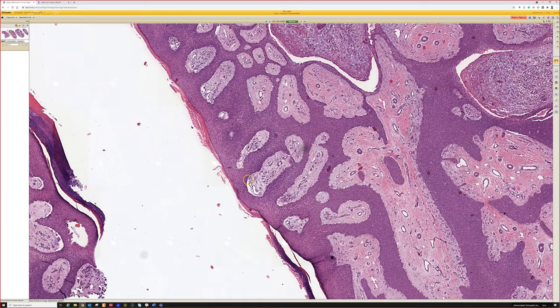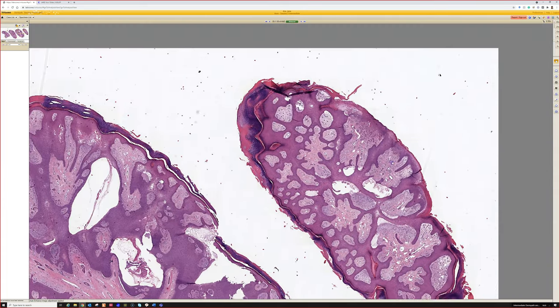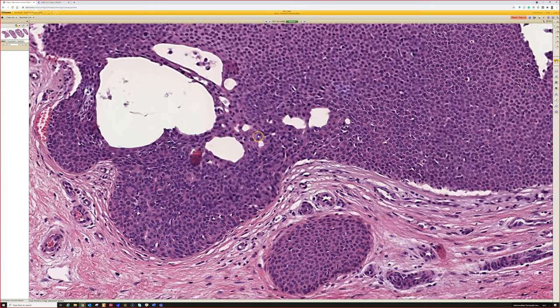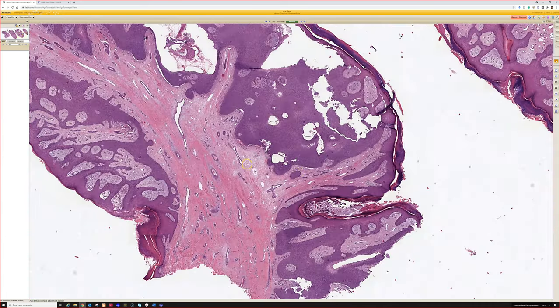situ. All right, well, I don't remember where the little tiny ducts were, and I guess it's not that important because all the other features here are very characteristic. So that is, oh, here, perfect. I just couldn't let it go. These are some little tiny duct lumens, and then these are the bigger, more cystic duct lumens. So that's a nice example of poroma.